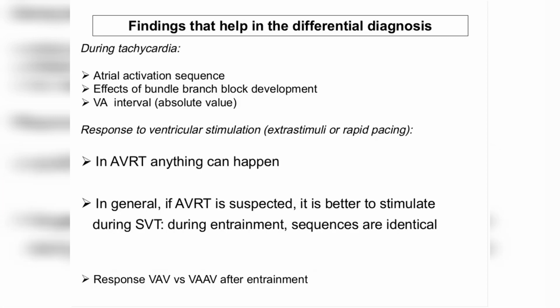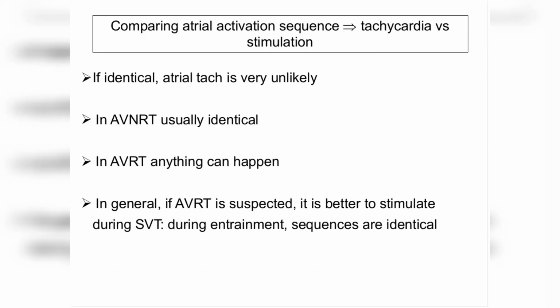So let me go ahead and start with the first maneuver, and that is to compare the atrial activation sequence during tachycardia with the atrial activation sequence during ventricular stimulation. If these two sequences are identical, that provides the information that an atrial tachycardia is highly unlikely.